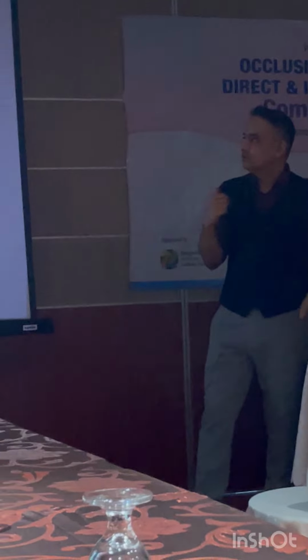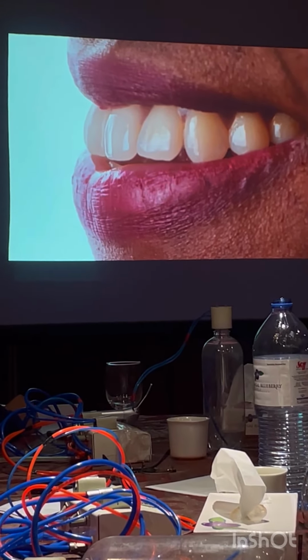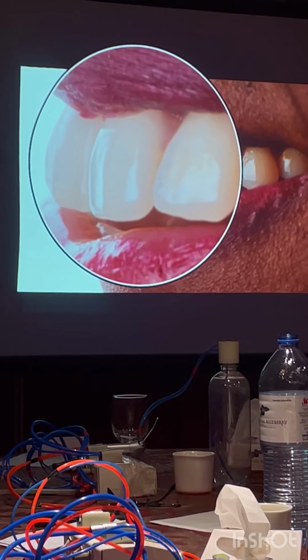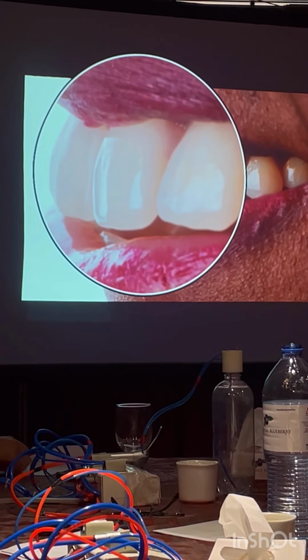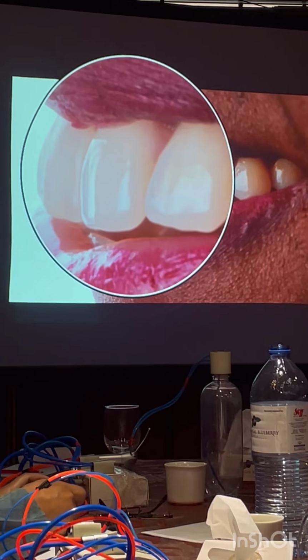The moment I change my angle, I come to the side of the patient. 9 o'clock. You see? Now what do I see? Texture. The textures. Beautiful depressions. Can you see the depressions? Wonderful. These are two depressions, mesial and distal. This is there in every patient. Every young female patient, I'm sure most of you would be having this here.